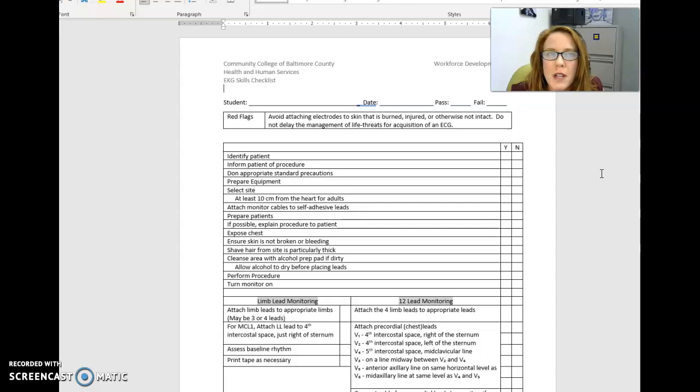And also just let you know, this is what is called a 12-lead EKG. You will probably see them in your sleep lab, but at your sleep lab, you will likely only have 3 electrodes that get put on the shoulders and 1 on the hip, or you'll have 2 that get put right around the clavicle, or you might get 1 put on front and 1 on back, and they do a beautiful EKG that you'll see in your montage.